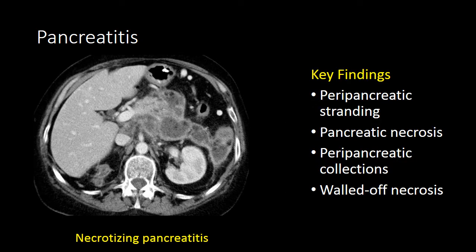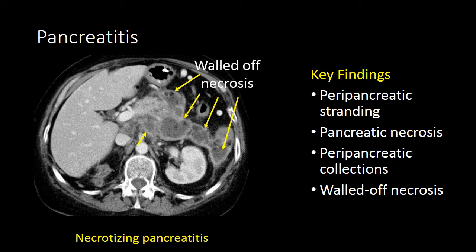Necrotizing pancreatitis is a more severe form of pancreatitis. The inflammation from the acute pancreatitis has resulted in necrosis of the pancreatic parenchyma and the development of multiple fluid collections around the pancreas and where the pancreas used to be. In this case, we can see multiple areas of necrosis with thick enhancing rims, commonly referred to as walled-off necrosis.